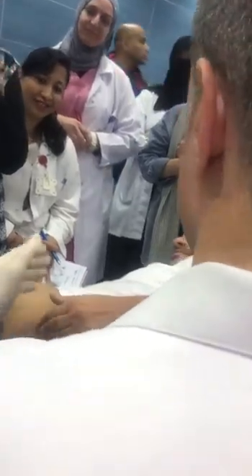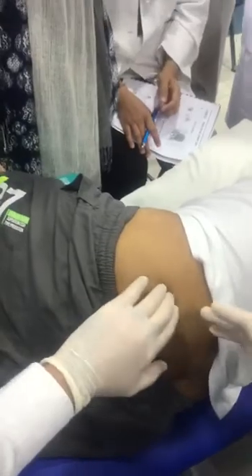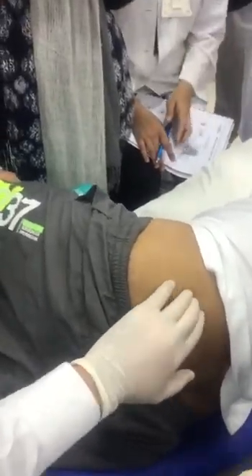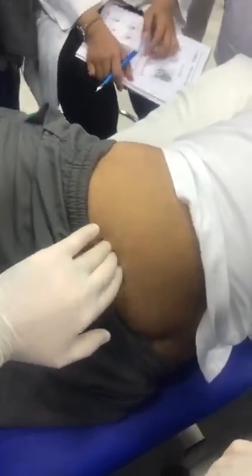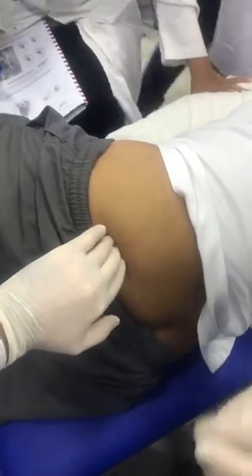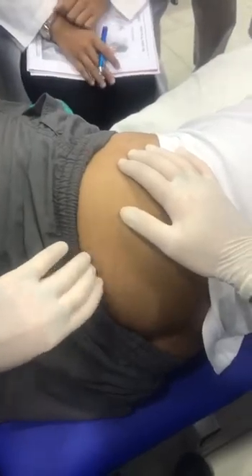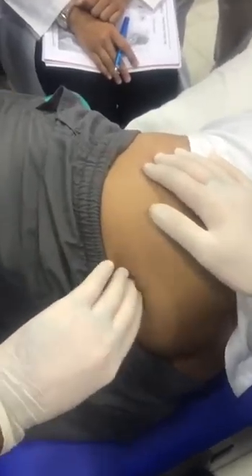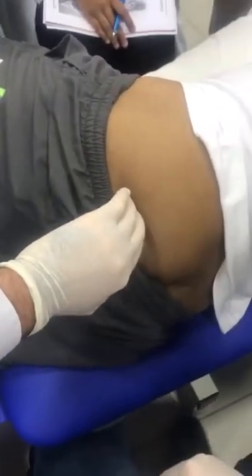Trochanter major. So more or less, if we imagine this should be like this. What we are going to do is place our fingers in this direction, which is the expected direction for the sulcus, and sometimes we can feel a bit of sulcus. So I'm going to palpate. This is very high, but here it seems a bit of sulcus. So I'm going to check here. Yeah, here I can find some sulcus. So more or less, I think this is what we were expecting, no?